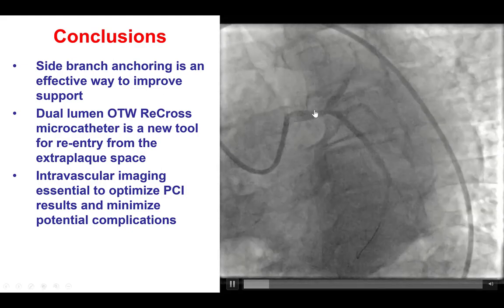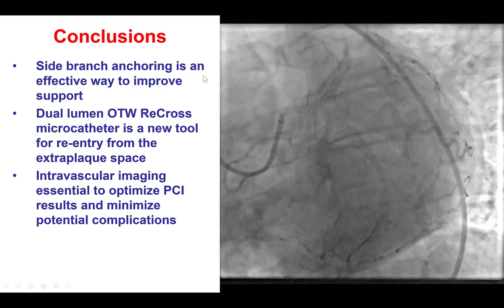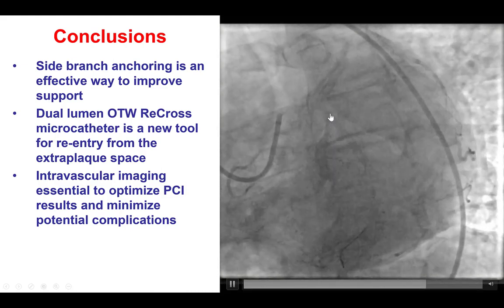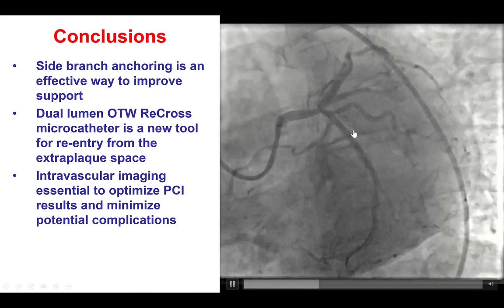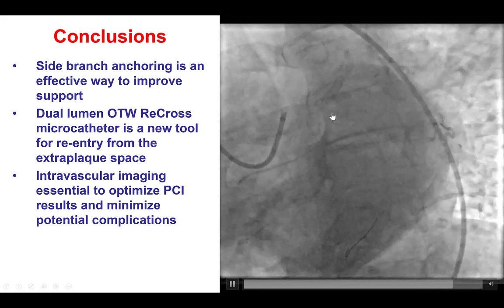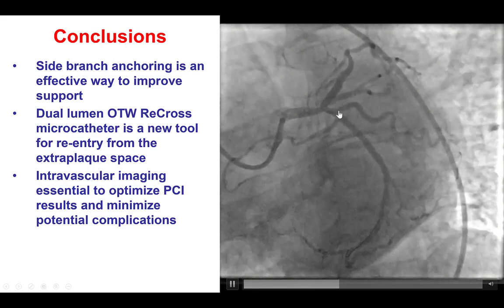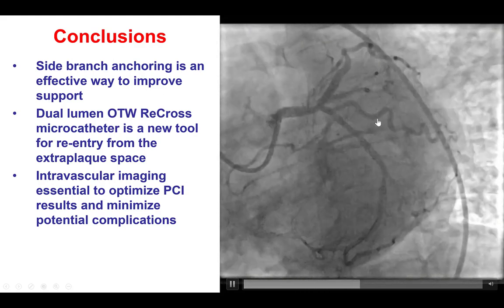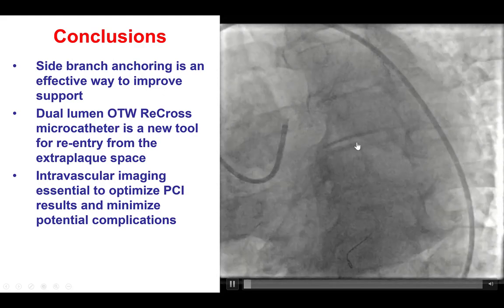The second lesson is how to approach balloon-uncrossable lesions. In this case, we did use a Sapphire 1.2 mm balloon, but despite that, we were unable to deliver equipment through the occlusion. We then used a side branch anchor by using a balloon into the Ramus branch, and we were then able to cross.